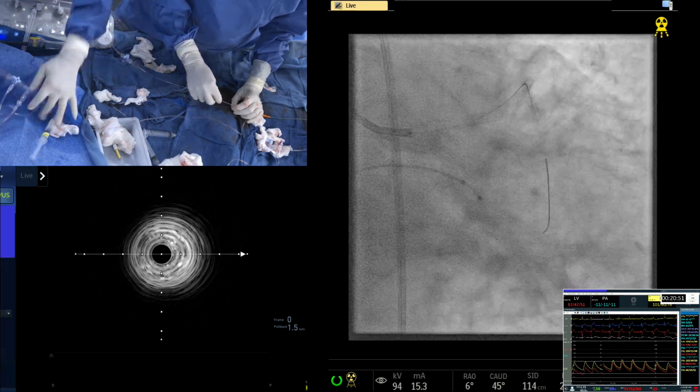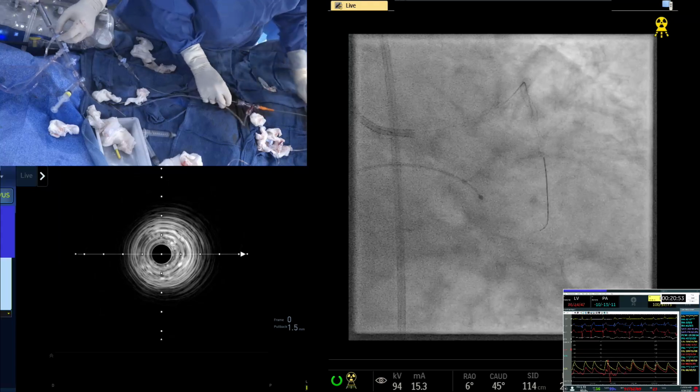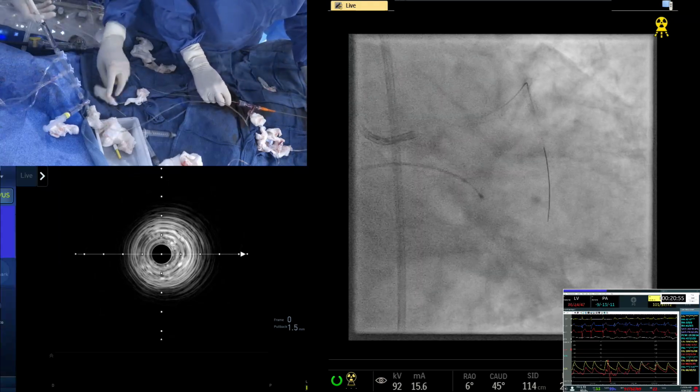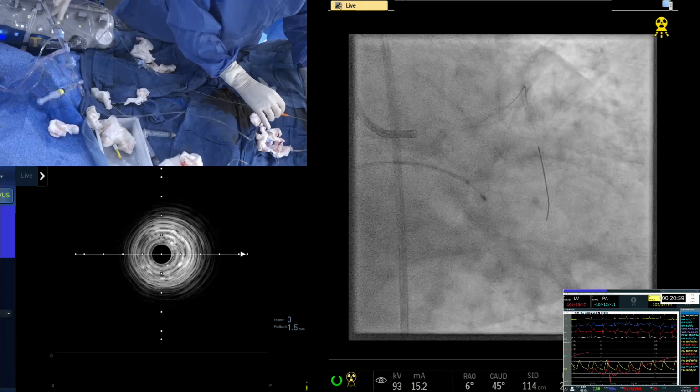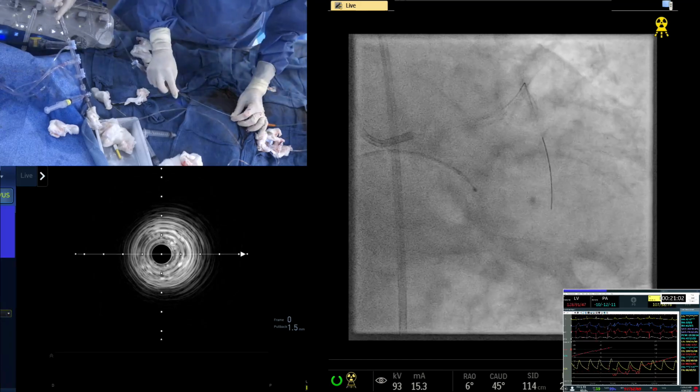And I think again, we are telling you that recrossing of the proximal cell or distal cell does not work. Just recross to the optimal cell. If you recross, it itself is good. Ready? Yeah.